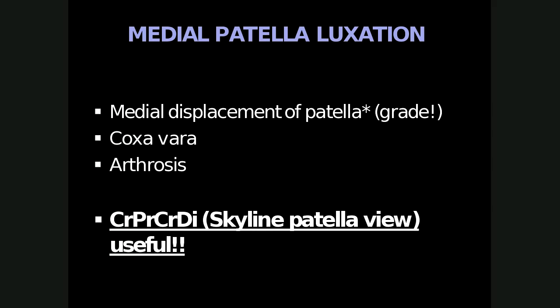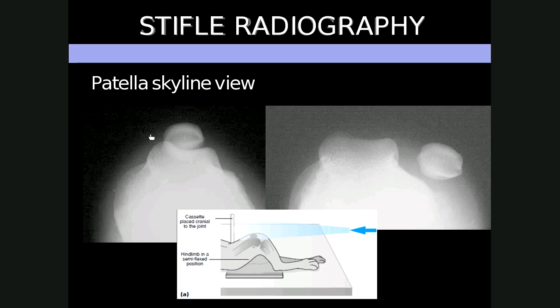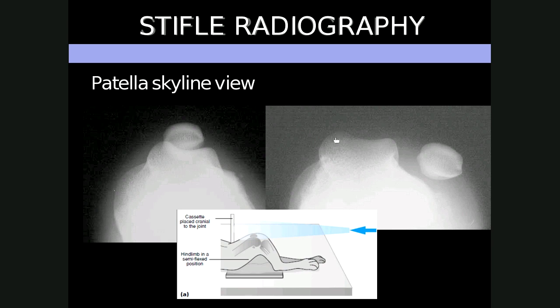Here is an example of a normal patella location within the trochlear groove, and here is an example of it being laterally displaced, with the medial and lateral trochlear ridges visible and the groove appearing slightly shallow.